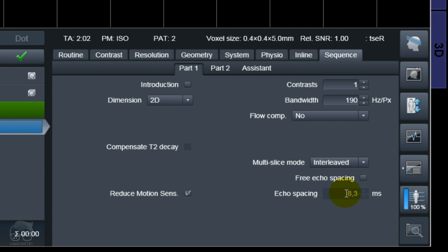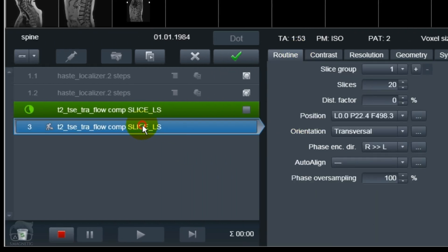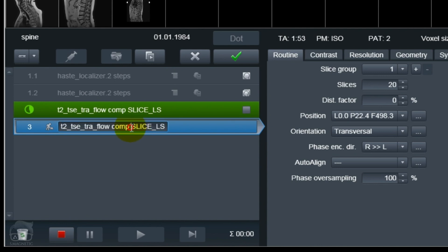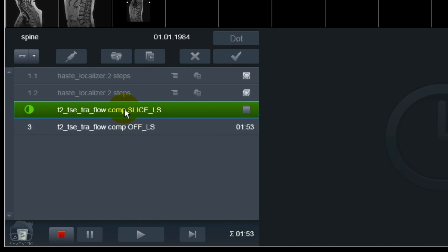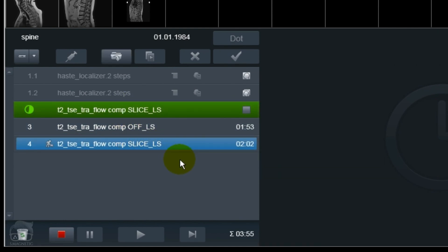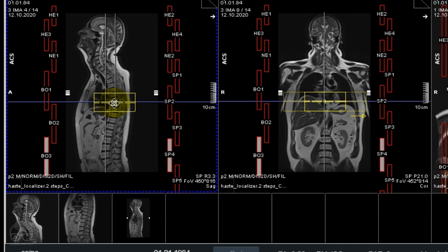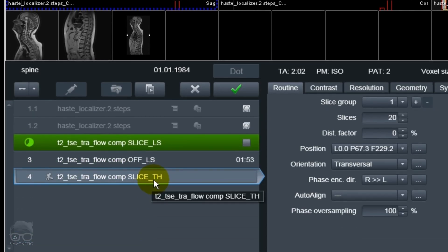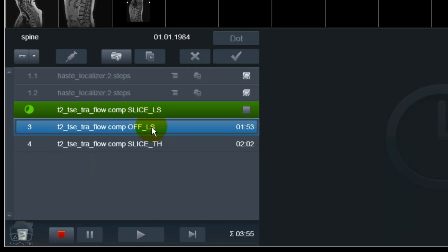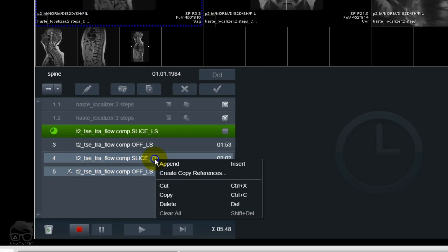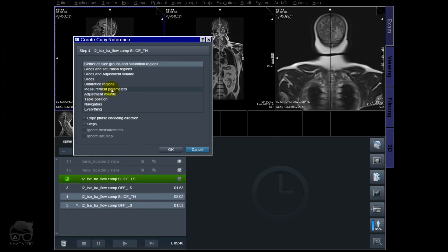Also, using flow compensation can increase the SAR, especially on 3T. I'm going to rename this one 'flow comp off.' Let's move to the T-spine. I'm just going to reposition this for the T-spine and do the same sequence — also with flow compensation off.